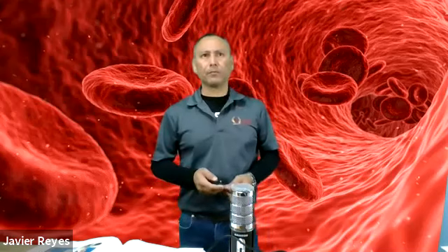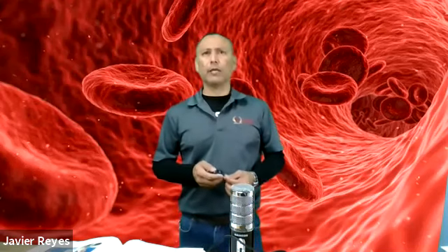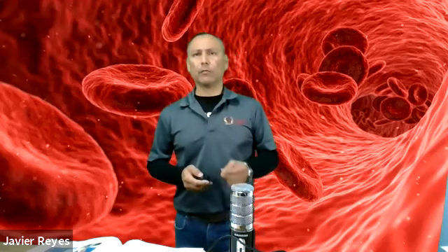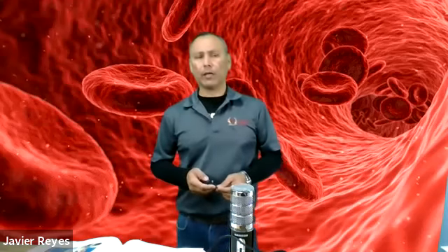These again fill by capillary action just like the other tubes. As soon as you present the microcollection tube to the blood, it will automatically fill that space. These tubes are filled with ammonium heparin, so they are coated with heparin, which is an anticoagulant, and therefore the blood will not coagulate. You need very, very small amounts of blood. Maybe a drop or two will be enough to fill these. They're used primarily for hematocrit determinations.